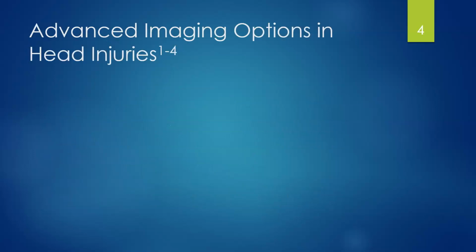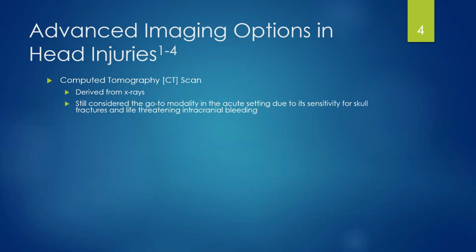Now that we've cleared through our learning objectives, let's start out very simple. What are our options for advanced imaging, and when would we consider using each? Starting from the top, we have our classic CT, or computed tomography. These are derived from X-rays, and they are still our go-to when it comes to the acute setting, because they have a very high sensitivity to things like fractures, because obviously they're X-ray based.